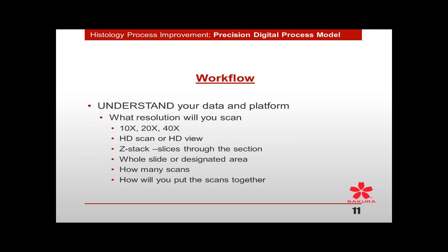What is the ultimate goal? You really start at the end, with what you want to achieve and enhance in that diagnosis, and work back. Is it whole slides, or designated areas? Either way, you're now going to start scanning slides, so you need to think about the way we've always cut and put sections on the slide. Do we need to put as many sections as we do now? Do we need to place those sections closer together? What's going to change in your microtomy protocols, because now you're going to be scanning. You want to make sure that all of those match together and help the system be as efficient as possible.